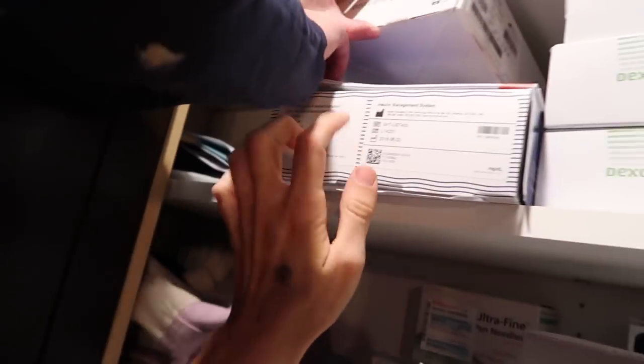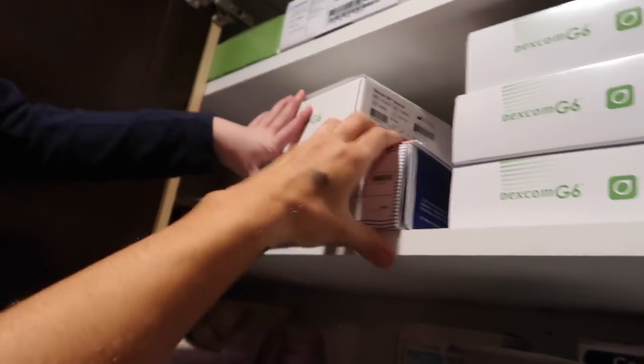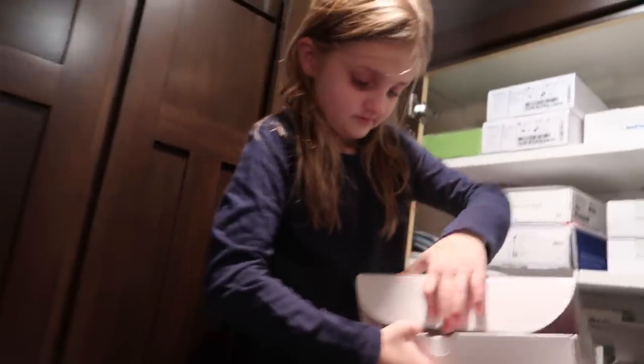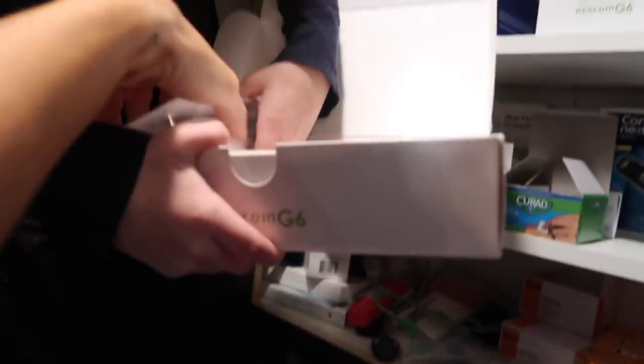This is her PDM for her Omnipod. And then these are basically the shots for her Dexcom G6. We have one more left, so you can see. I love this one way better — it doesn't hurt.